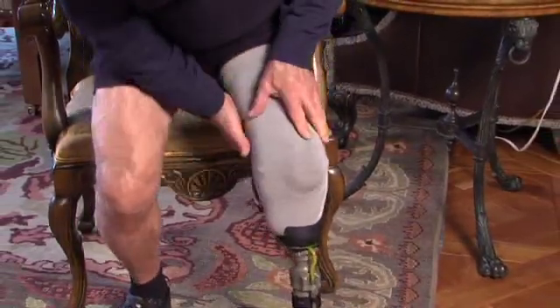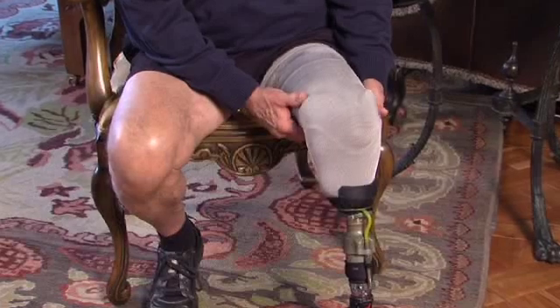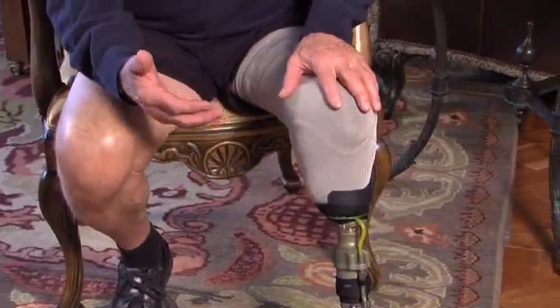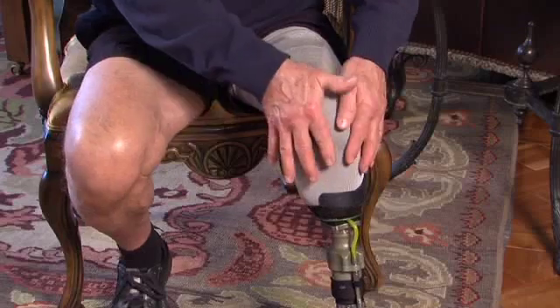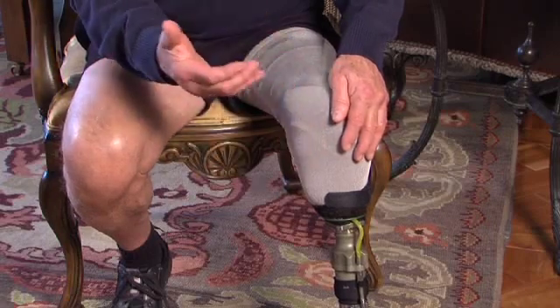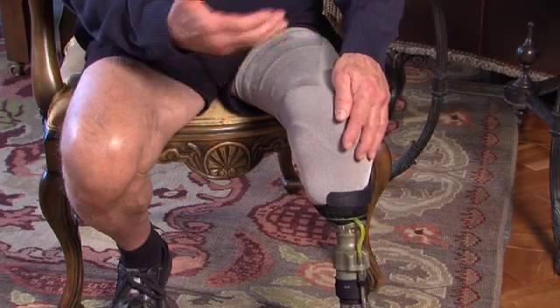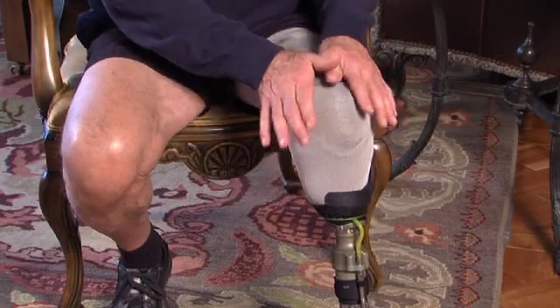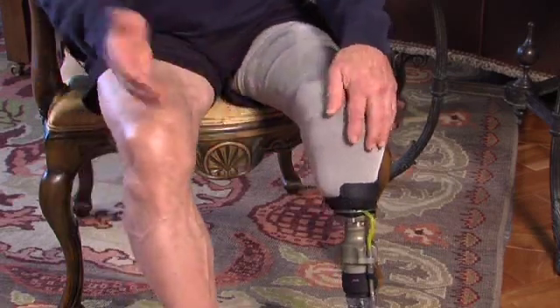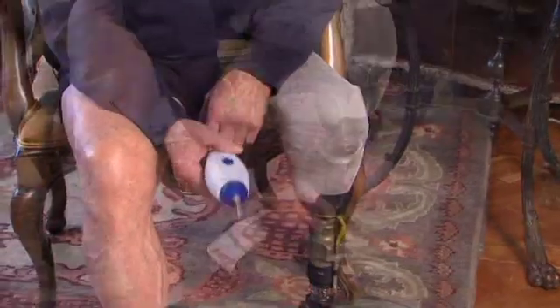We just bring our sleeve up like so. Make sure all the wrinkles are out. The thing that a lot of people have trouble with with sleeves is the fact that when you normally draw a vacuum by walking around, your knee's pretty straight. And with the knee straight and then drawing vacuum, you lock all of this material down straight. So what we want to do to improve the ability to bend your knee easier, we want to draw our vacuum in a flexed position. That way we've pre-stretched all of this material over the knee so that it's locked down in an already flexed position.